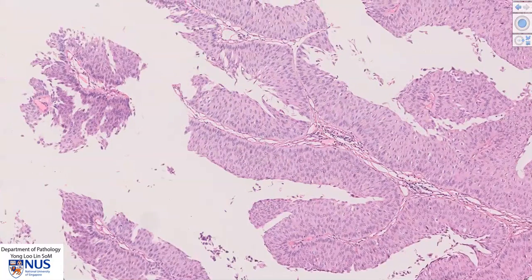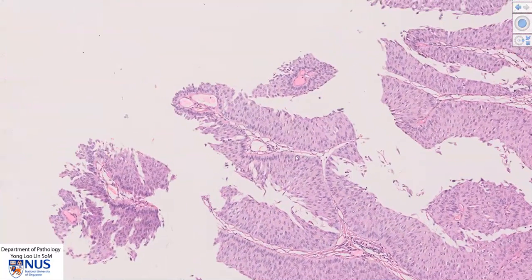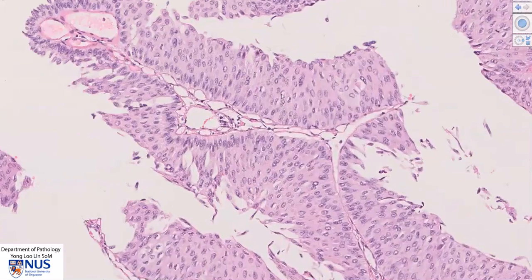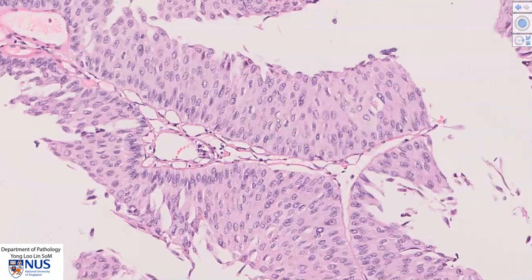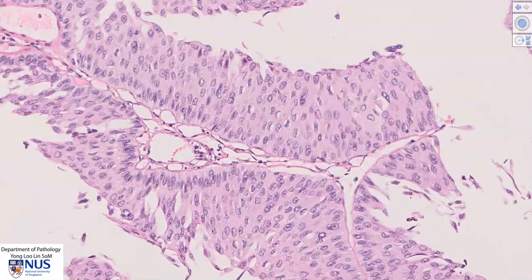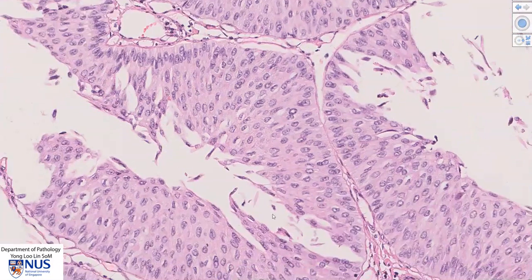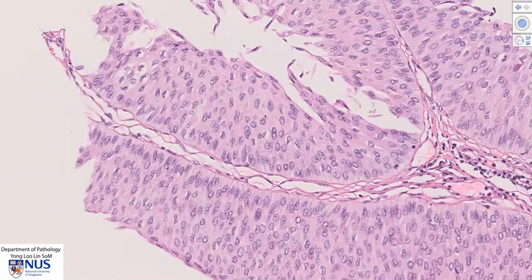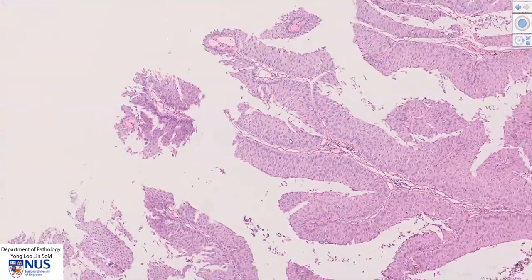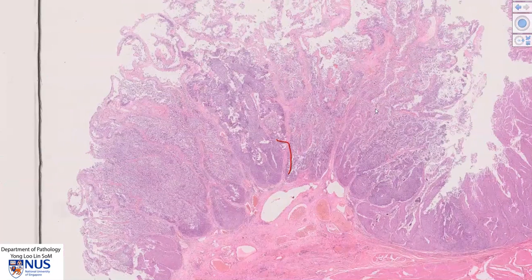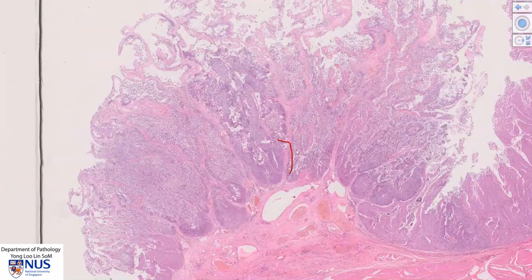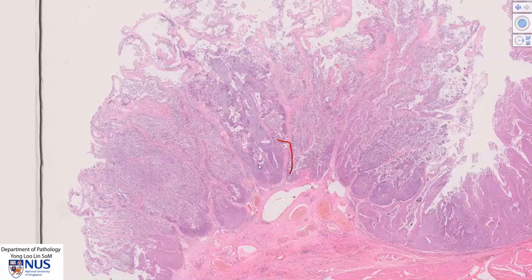The neoplastic urothelial cells show quite a variable degree of architectural as well as nuclear atypia. In this area, there is some nuclear enlargement and some atypia, with occasional cells showing more marked nuclear enlargement and also nuclear membrane irregularity. However, if we move to other areas — and this is often the case in papillary urothelial carcinoma — we can see variable degrees of nuclear atypia.